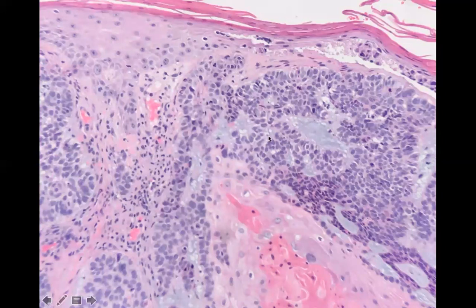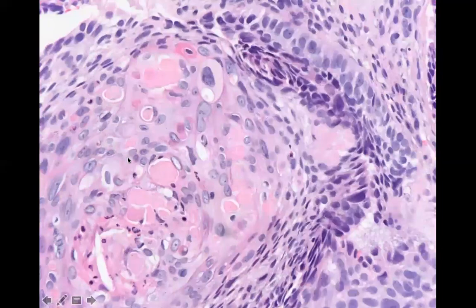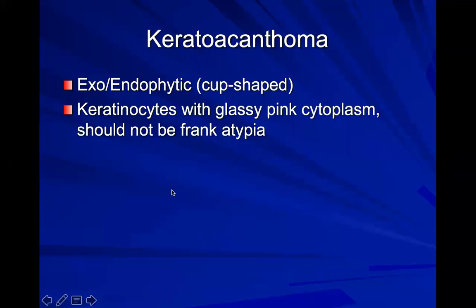Here, on the other hand, is a basal cell with this very significant squamatization. This is in the reticular dermis where you've got this basaloid edge and this very squamey look in the middle. That's a true basosquamous carcinoma, not the irritated ones with the squamey look on top.